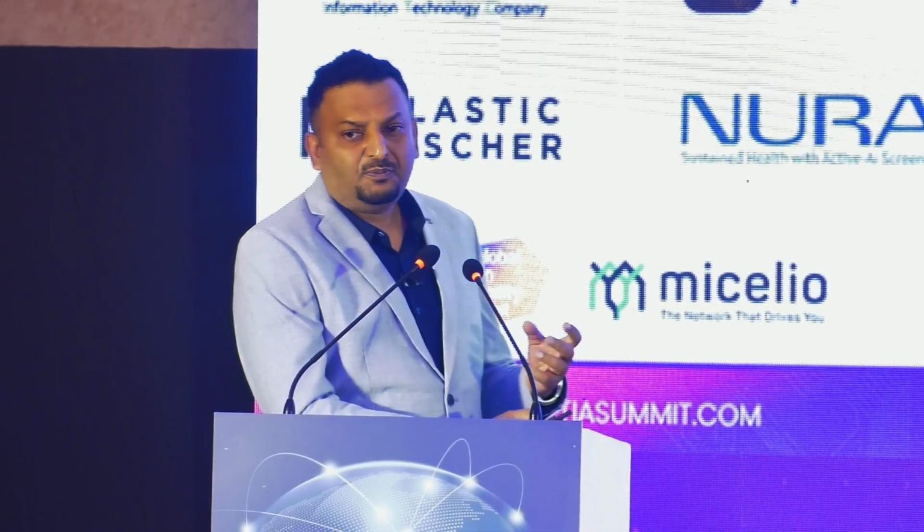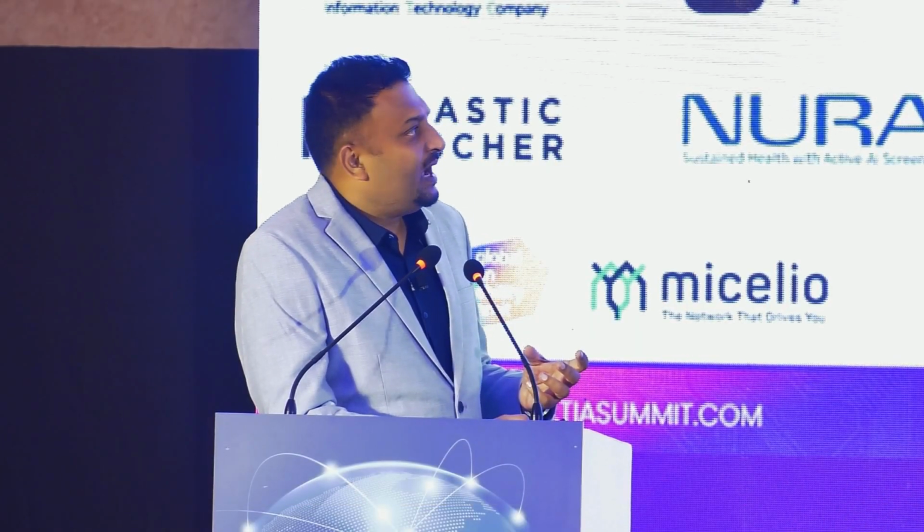One of the examples of its applications is in patients with sepsis in ICU. These patients are very sick, they deteriorate very quickly, and there is a sepsis patient who is admitted in ICU. He is on ventilator, dialysis, and inotropes, so he requires urgent treatment. However, we cannot shift him to radiology because we have to disconnect all the tubes and the patient might die on the way. So it's very difficult to diagnose what's going on inside in these patients. So in these patients, we can perform these scopies inside an ICU. We can go inside, have a look, and come to a quick and definitive diagnosis in these patients, and these procedures can be life-saving in these patients.